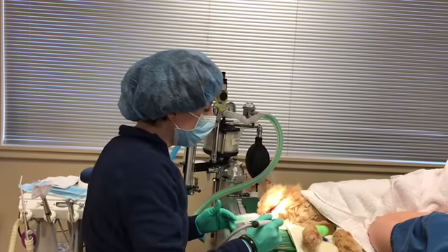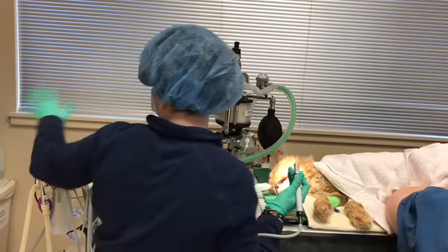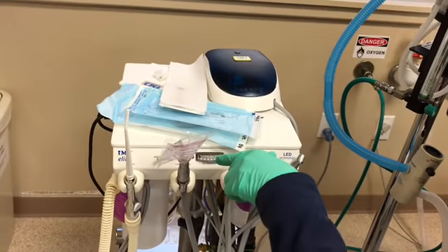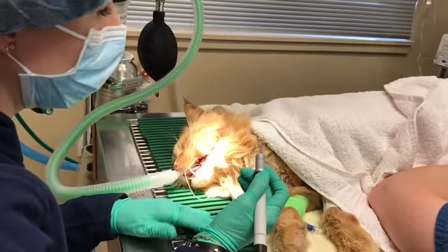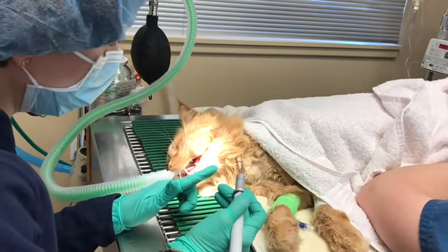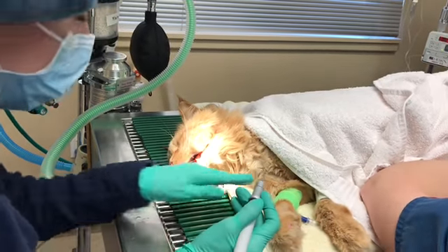So I'm going to clean this cat's teeth. What I have here is the scaler. This is the dental machine. This has the polisher, the drill, and the air water syringe. What I'm going to do is clean these teeth. You want to go at a side angle, not straight on, and no longer than 10 seconds per tooth because you could damage the tooth.